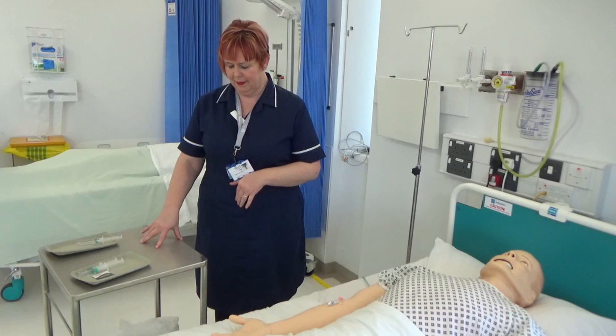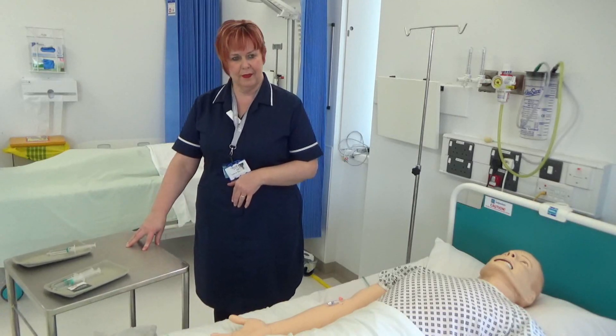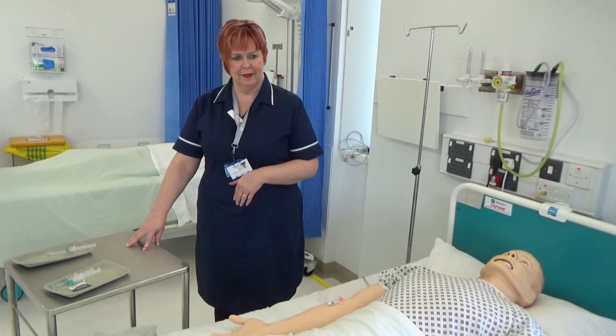Clean hands as per trust policy and check e-med's codex for medication, dose, date and time of administration, route, method of administration, allergies and sensitivities, and time of last administration. This is to ensure that the patient is given the correct medication in the prescribed dose by the correct route, using the right method at the right time.